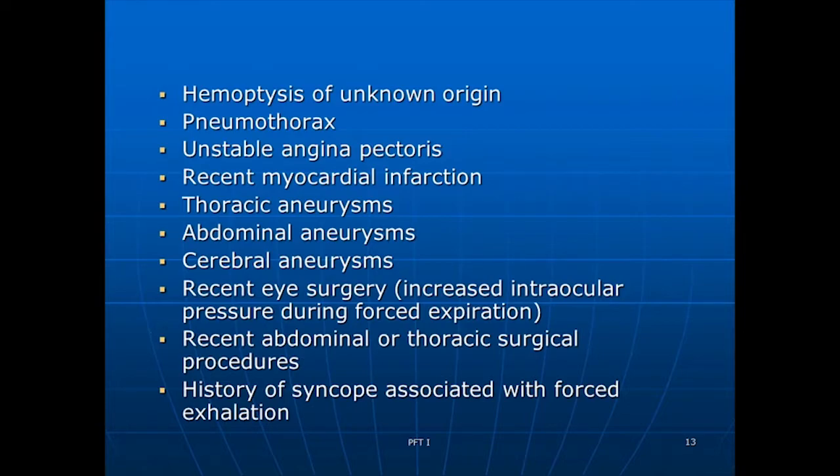Well, we're going to talk about pulmonary function studies that we're going to see patients. They're going to be using a spirometer, and they're going to tell these patients to take a big, deep breath in, as big as possible. Then they're going to tell them to blow this volume out of their lungs as quickly and as fast as possible. So it takes a lot of effort. So there's a lot of effort when these patients blow out into this spirometer.